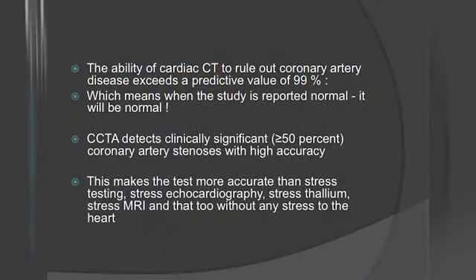CCTA detects clinically significant, which is more than 50% stenosis, with a very high accuracy. And the test is actually more accurate than stress test, stress echo, stress thallium, stress MR, without any stress. Okay?